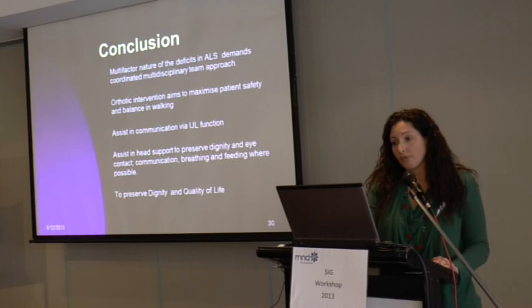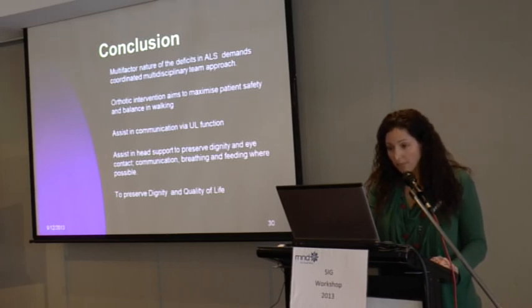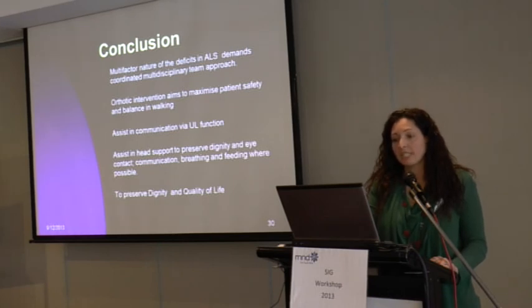The multi-factor nature of ALS deficits demands a coordinated, multidisciplinary team approach. Orthotic intervention aims to maximise patient safety and balance in walking. It aims to assist with upper limb hand function, to assist with their communication, and it also aims to support their head and preserve their dignity, give them that eye contact, assist with their breathing and their feeding if possible, and to preserve their dignity and quality of life.